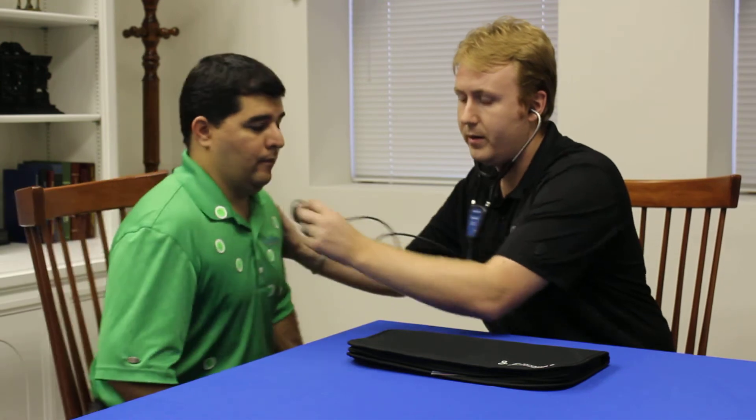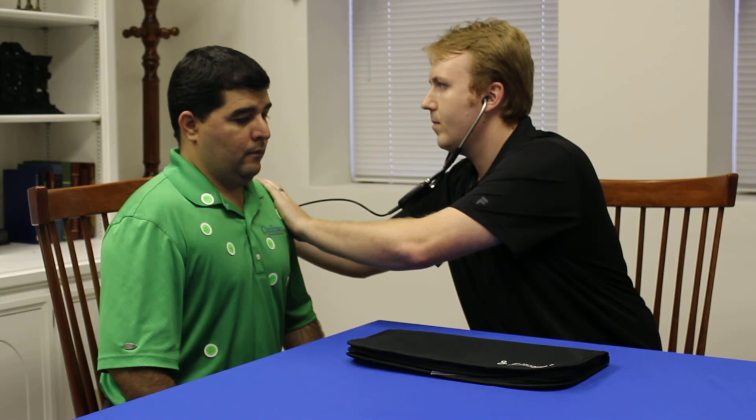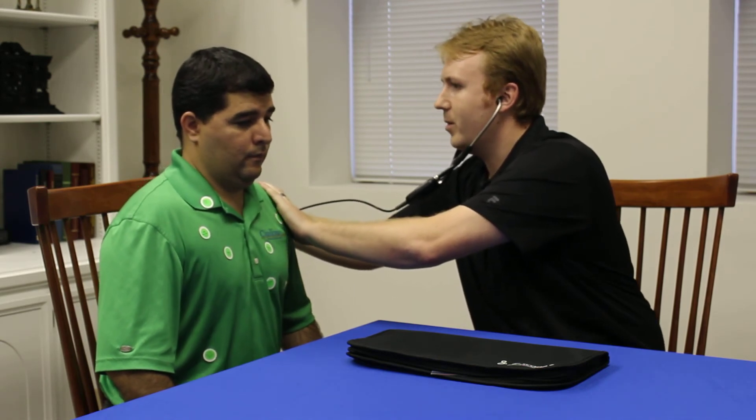The student needs to turn on the stethoscope — it'll say 'system activation mode one.' Now as I go over the locations of your heart, breath, and bowel sounds seamlessly... All right, your heart sounds sound normal. Let's listen to your lungs — can I get a deep breath in? You're definitely having some obstruction in the lungs, Mr. Hernandez. Your asthma is definitely acting up — we're going to need to get you on a regimen using that inhaler.